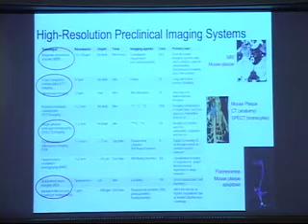So you have the option, and you have a whole series or laundry list of techniques, from MRI to micro-CT to nuclear imaging to bioluminescence imaging, very familiar here. You could look at plaque in the mouse by MRI. You could look further, let's say, at monocyte trafficking using SPECT imaging, or you could look at cell death by using bioluminescence or fluorescent imaging.